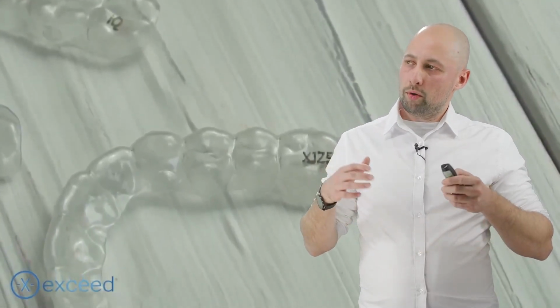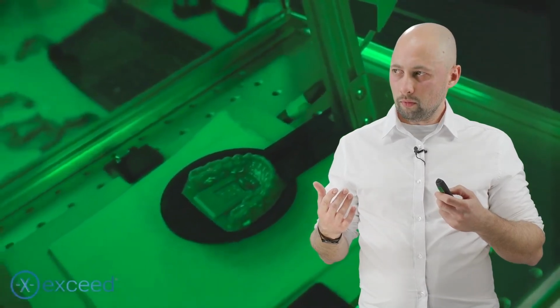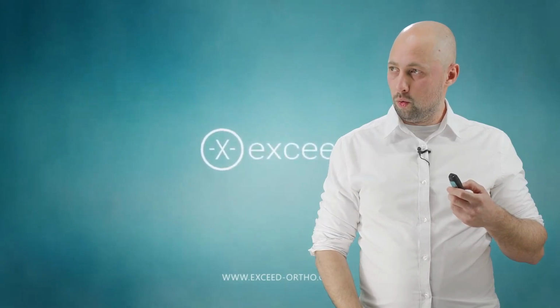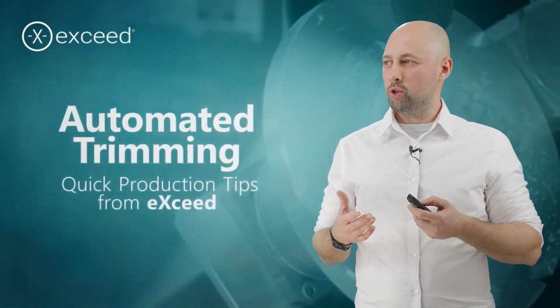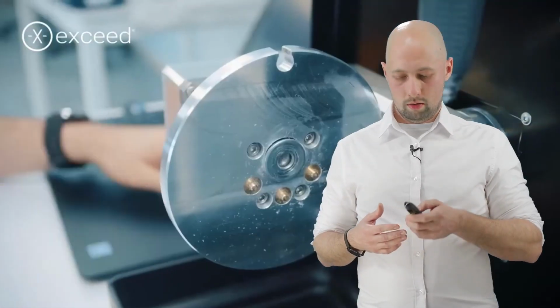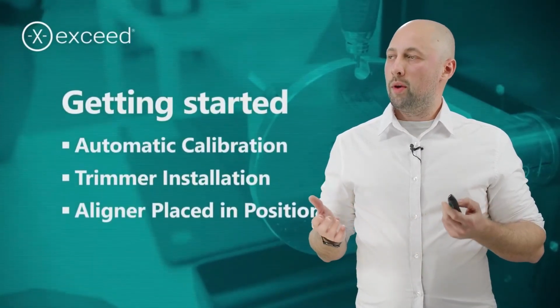So the process is the following. First of all, you mark your aligners, and then you automatically trim them. So this is an automated trimming machine, which allows you to automatically trim your aligners.